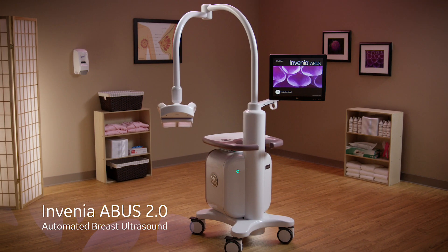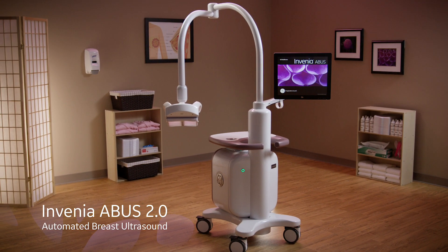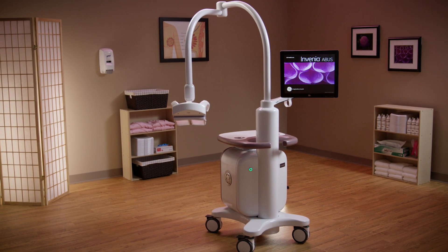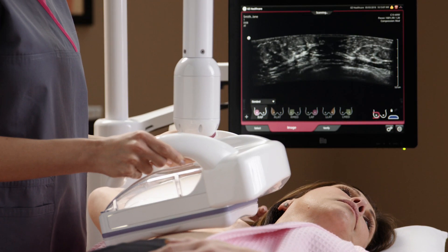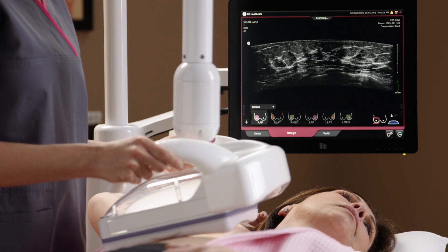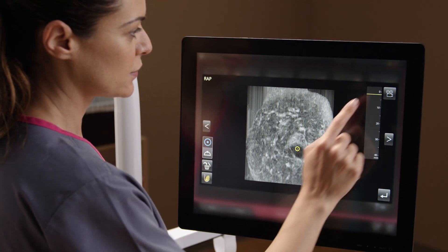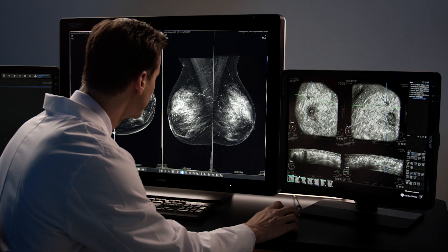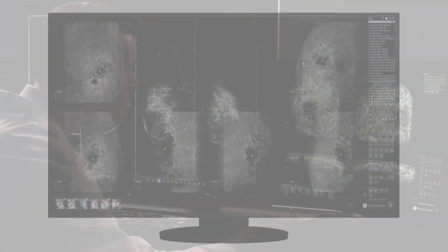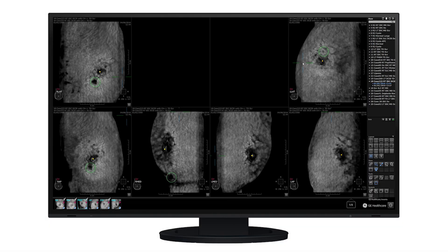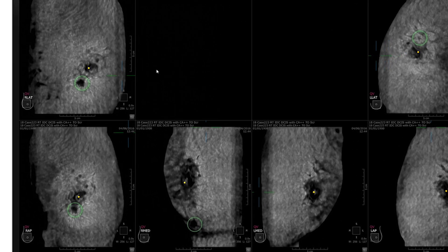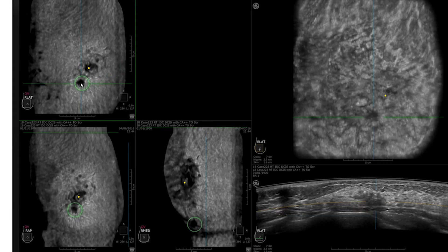Invenia A-Bus 2.0 uses advanced 3D ultrasound for dense breast tissue imaging to improve early detection of breast cancer. The Invenia A-Bus viewer, now featuring AI assistant, enables enhanced review of 3D A-Bus datasets.